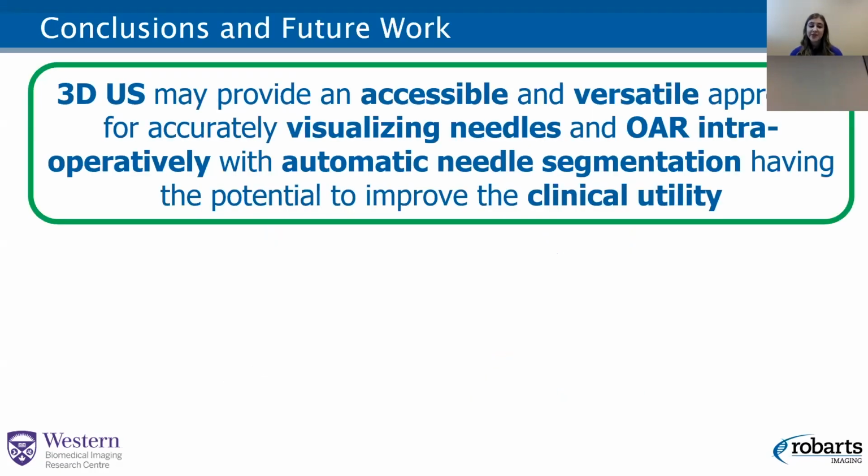So overall, based on the work that we have done so far, we do believe that 3D ultrasound may provide both an accessible and a versatile approach to accurately visualize both our needles and our organs at risk intraoperatively during high-dose rate interstitial brachytherapy procedures, with automatic needle segmentation having the potential to improve the clinical utility of the system, and with some potential moving forward to be able to look at intracavitary applicators.